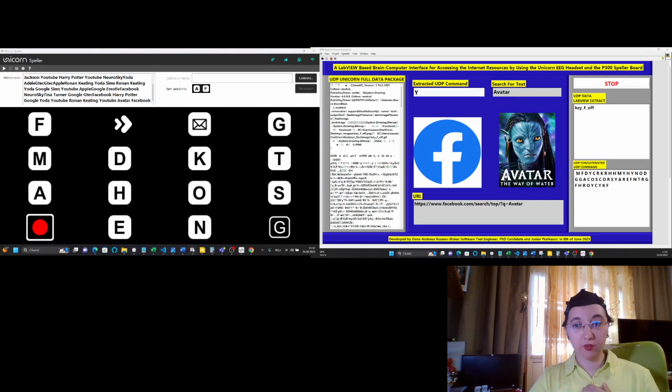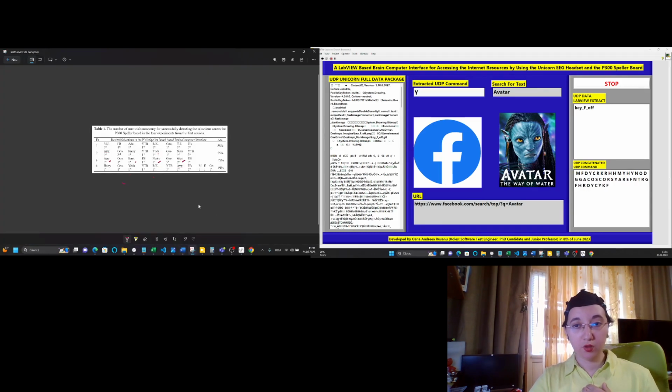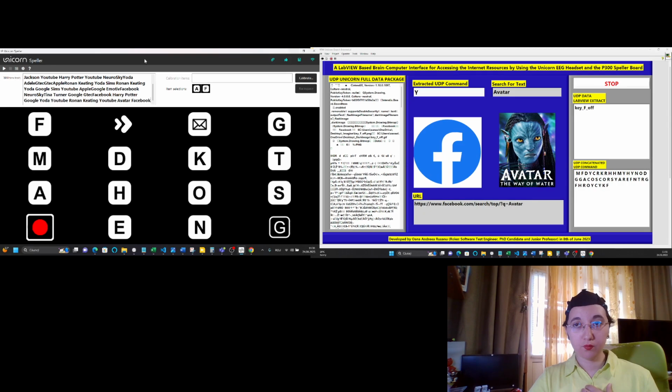Now the next task will be to search for Gmail. So we will try to detect Gmail. I don't expect any action to happen, so just check the Gmail. Then the last task would be to search for Emotiv in Google. So this icon should be selected, Gmail.